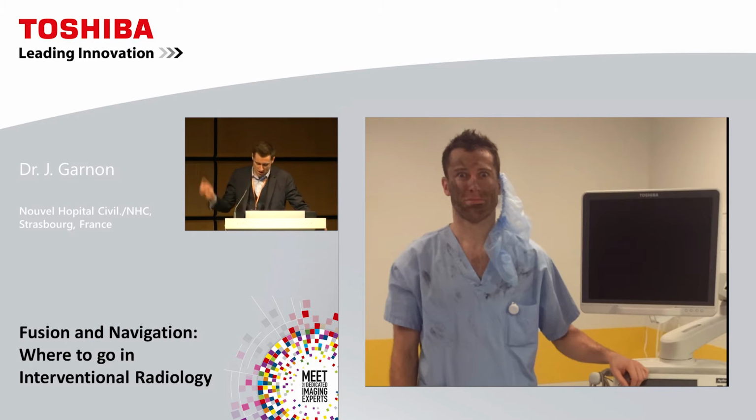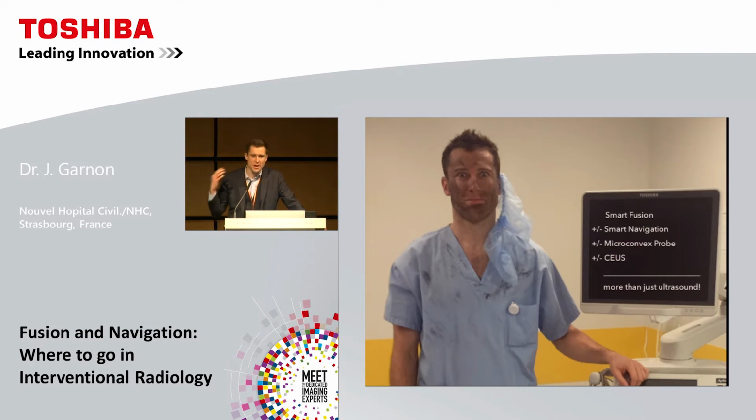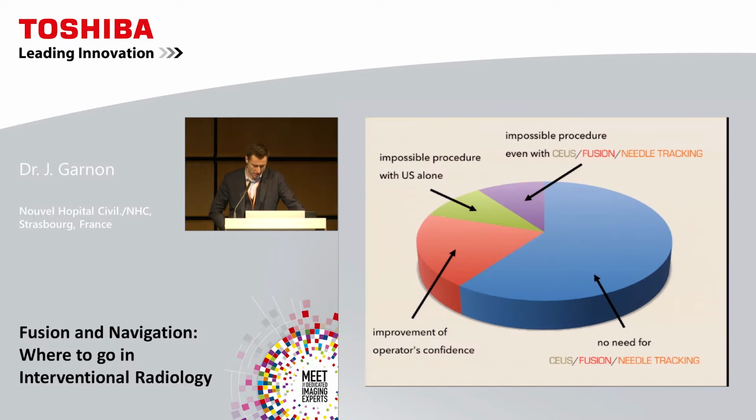And this was not without any cheating. So why is it dynamite? Because when you combine everything together, you clearly get something, from my point of view, which is more than just ultrasound. Let me explain. Of course, the majority of procedures can still be performed using ultrasound guidance alone. However, you will improve your confidence and the quality of the intervention in some complex cases, and you will even be able to perform procedures which are impossible to do with ultrasound alone.